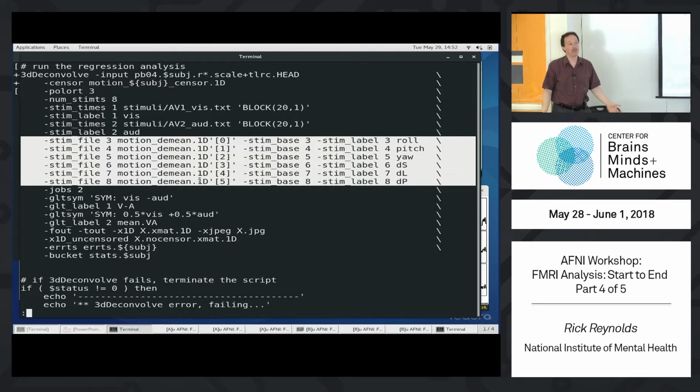If you have 10 runs of data and you throw 6 parameters across all 10 runs, they're not going to explain very much variance. Sometimes they'll match, sometimes they won't. So they get less useful the more runs they would have to cover. So it's better to do that per run. And the AFNI examples, I think, mostly show per run. So that's our model.